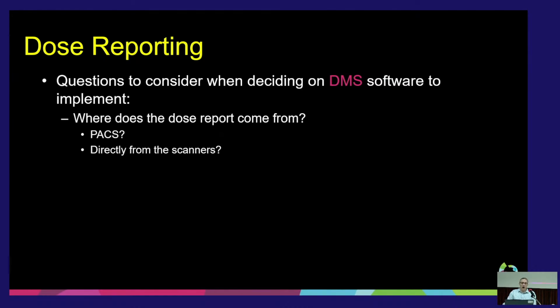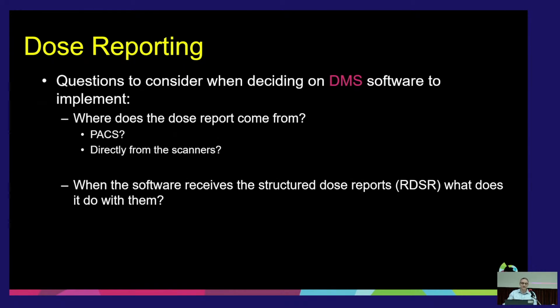So where the dose monitoring software gets its data is important, because some are more user intense, and you have to interact with it more than others.